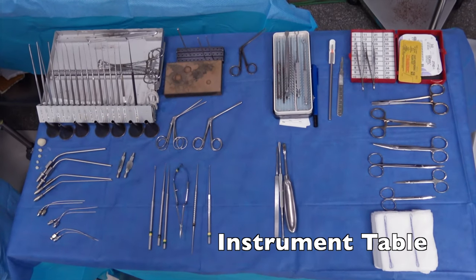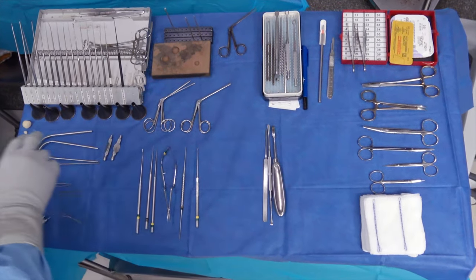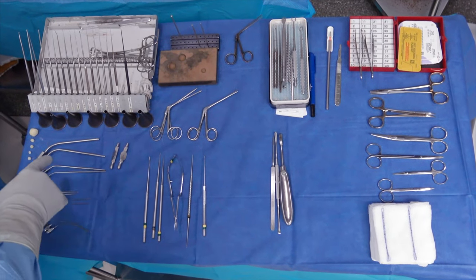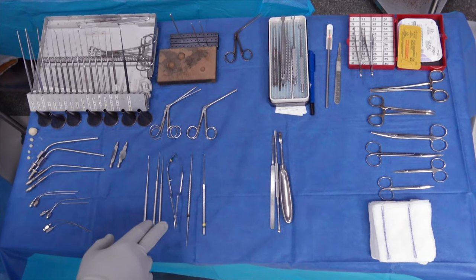This is a microsurgical table for ear surgery. We have our standard micro-instruments here, we have our assortment of speculums, different size suctions, and we have some additional micro-instruments including micro-scissors.